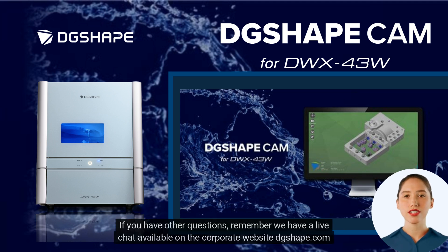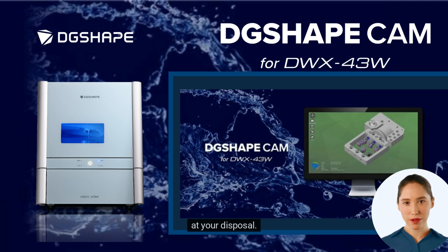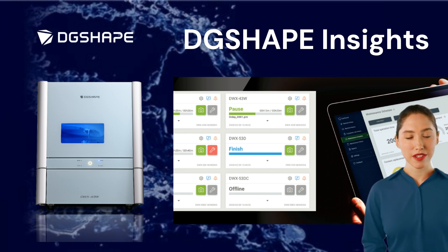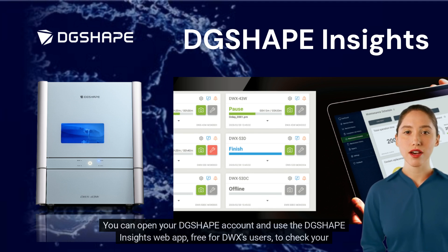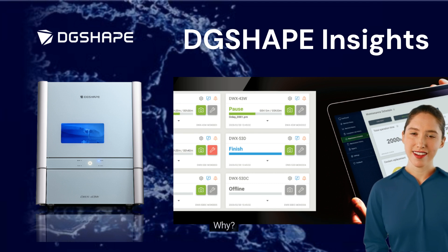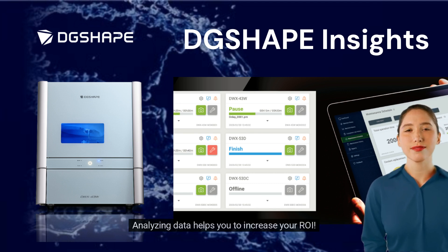If you have other questions, remember we have a live chat available on the corporate website DGShape.com at your disposal. We care about your business, and the DWX43W allows you to stay at the forefront of dental innovation easily. You can open your DGShape account and use the DGShape Insights web app — free for DWX users — to check your data, check maintenance, and make many analyses. Analyzing data helps you to increase your ROI.